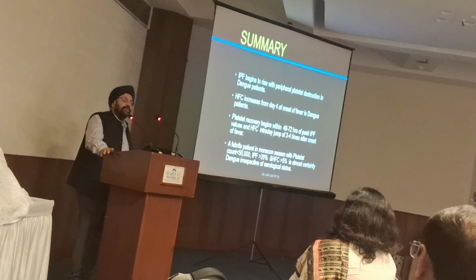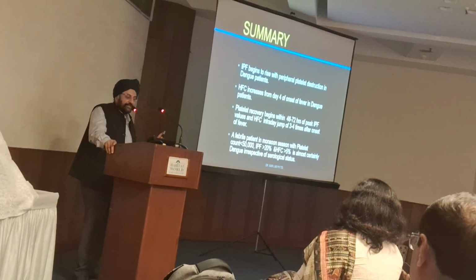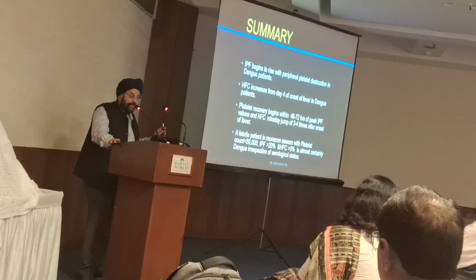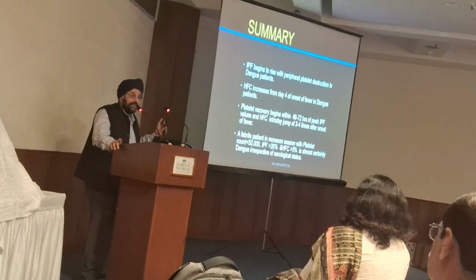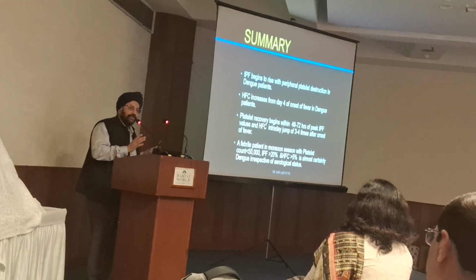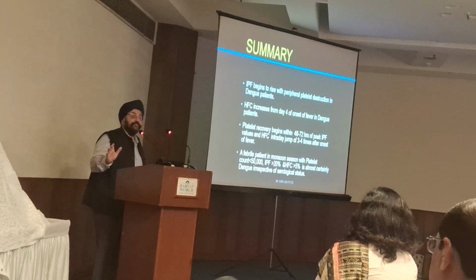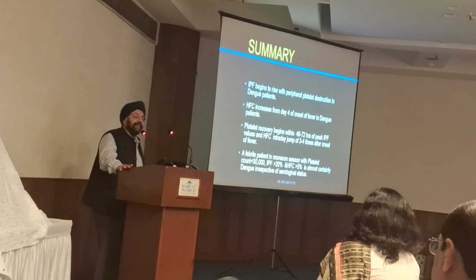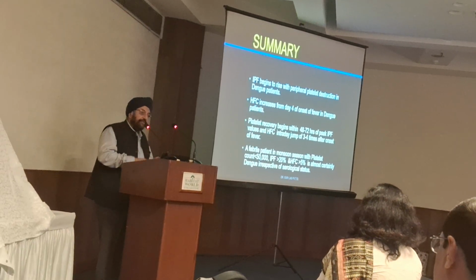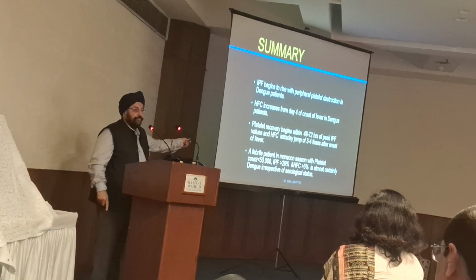A febrile patient in monsoon season with platelet count less than 50,000, IPF more than 20%, and HFC more than 5% total is almost certainly dengue irrespective of the serological status. I am saying irrespective of the serological status because NS1 antigen usually remains positive for the first 4 to 5 days. Even on the 5th day, sensitivity falls from 95% to about 65%. And the antibodies sometimes don't come by day 7 to day 8. So that period between day 5 and day 7 is the window where both your antigen and your antibodies could be negative. But this CBC is going to give it away for you.